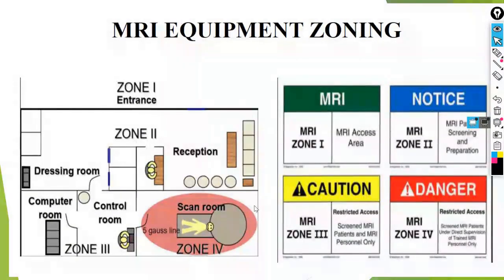Right now, there is an anesthesia machine that is compatible, of course, with the device, but you will have to pay for it, I swear.